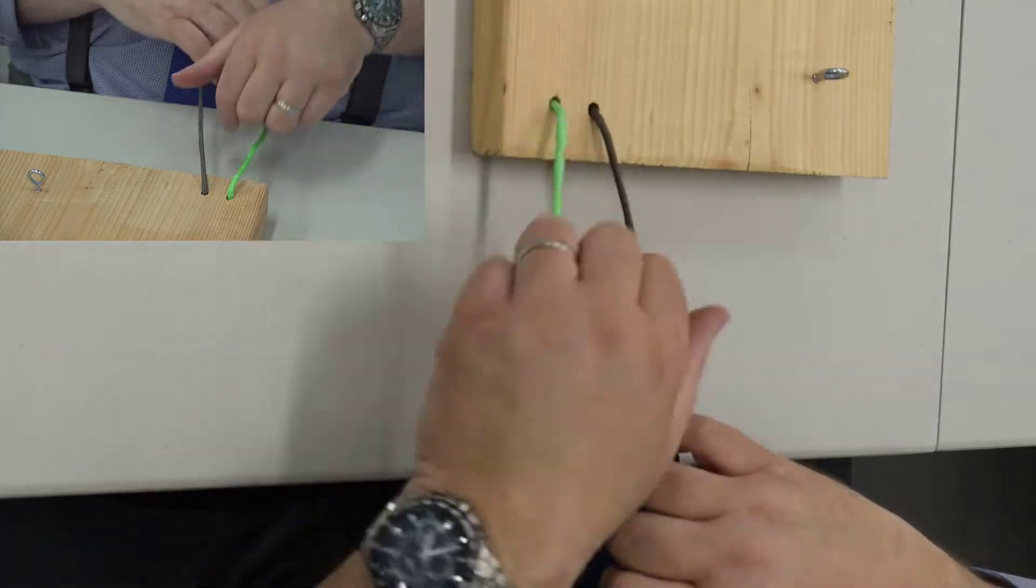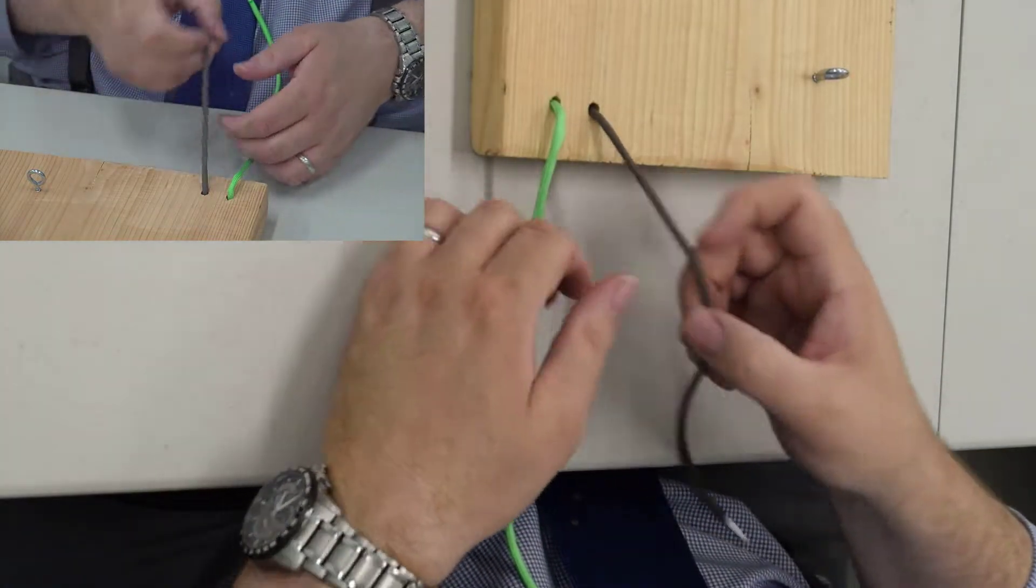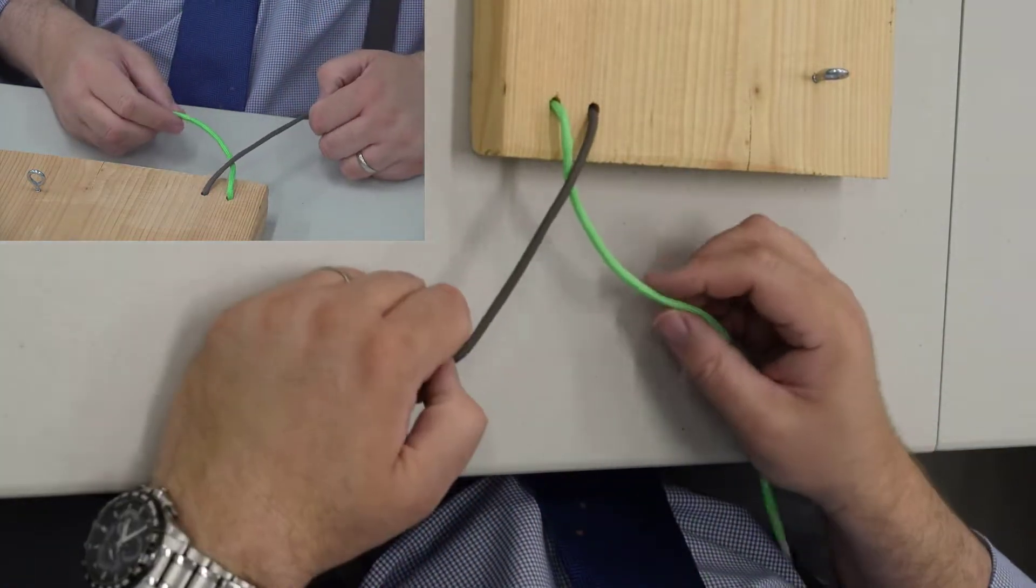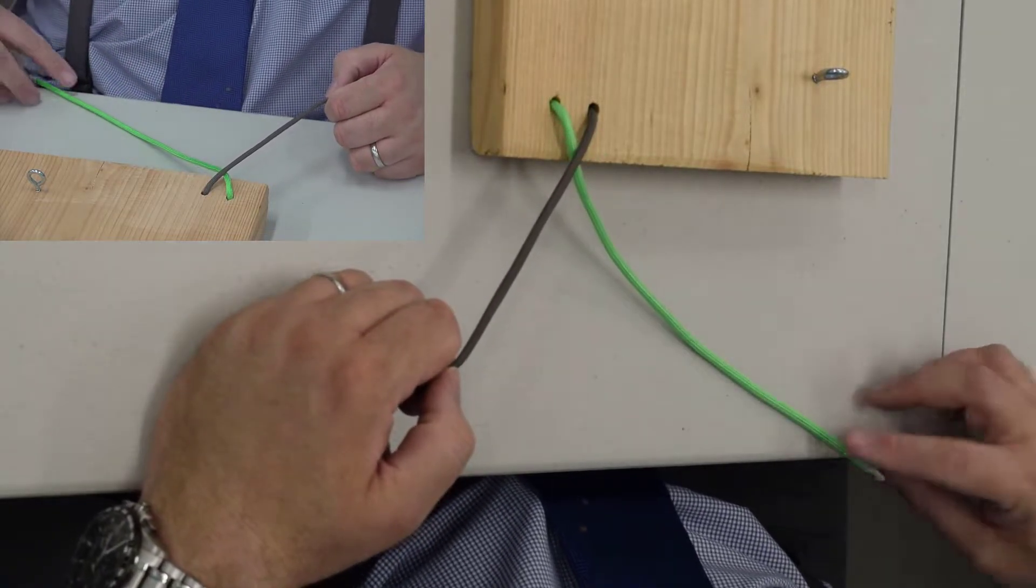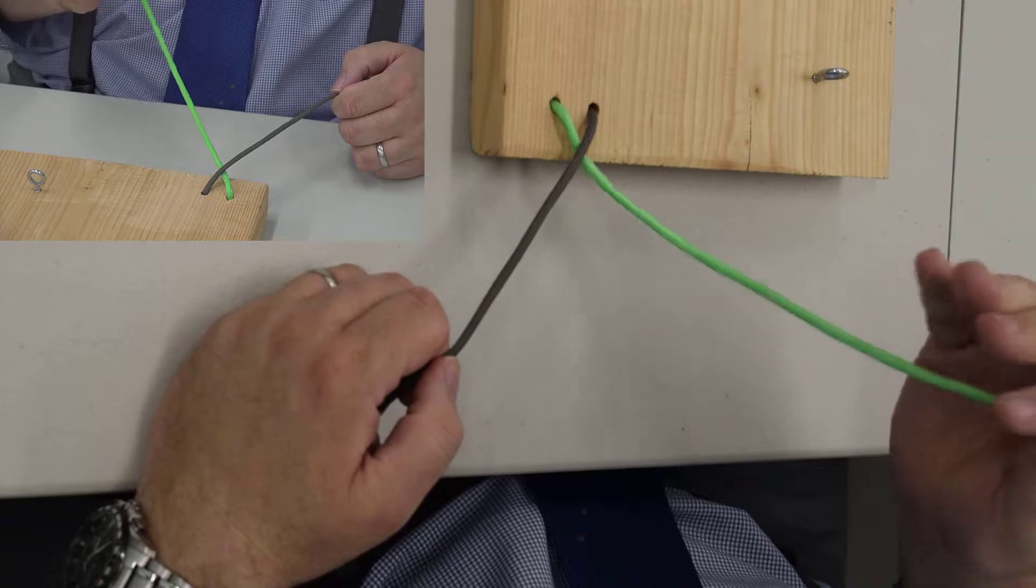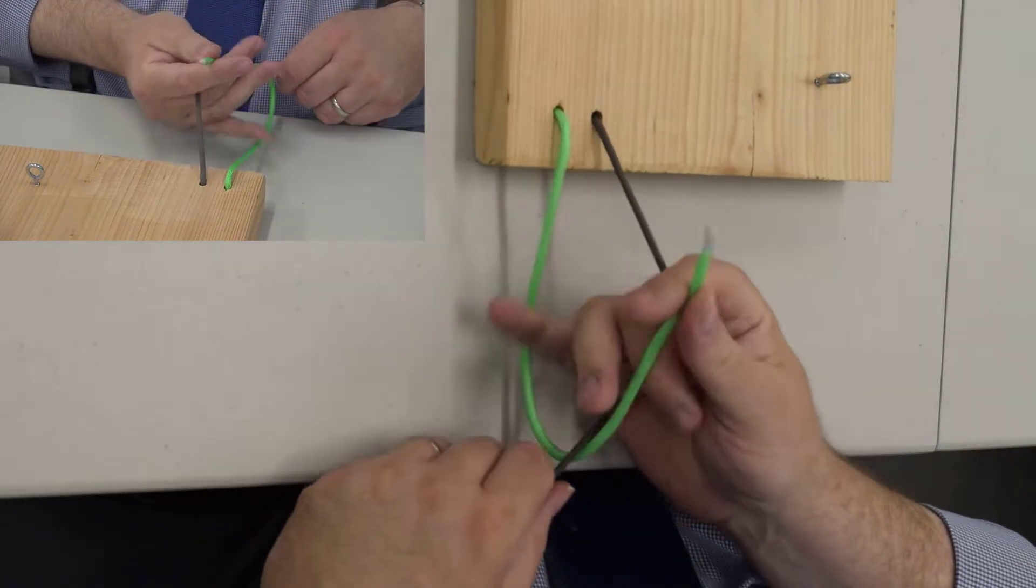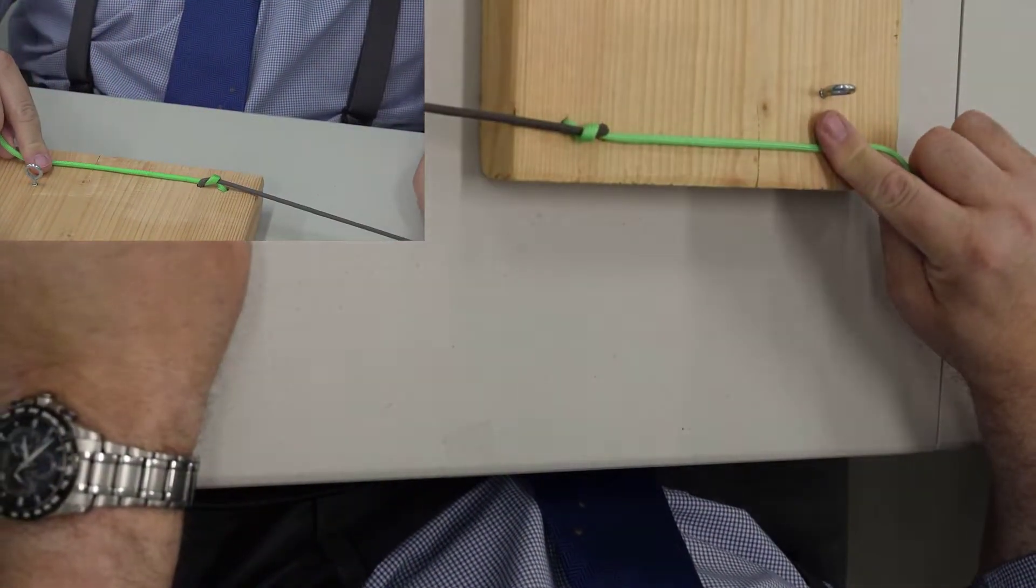If we reverse it and say the brown is over the green, this is set up for me to do the break. And now it comes down nice and pretty.